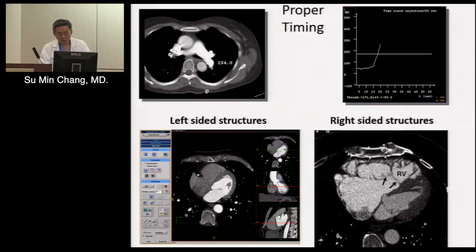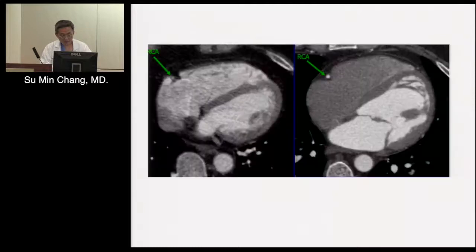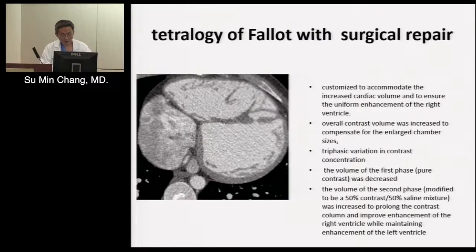before you tell your tech. I think personally, all you guys rotating through the CT lab, unless the indication is abnormal stress test or TAVR, for any other indication which sounds not so clear, I would suggest that you pick up the phone and talk to the referring doctor. That will save you the trouble and save the patient the need maybe for another study. Okay.